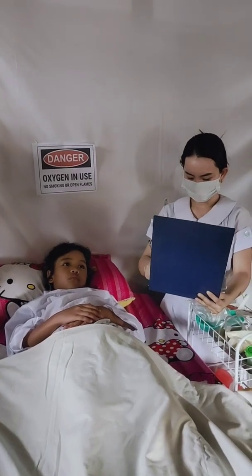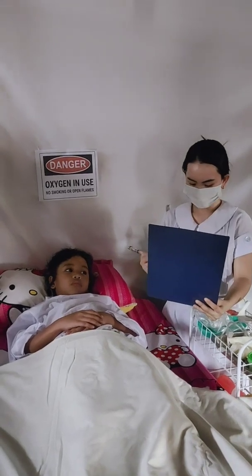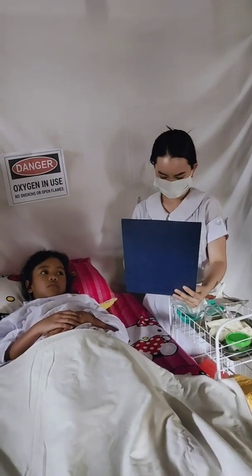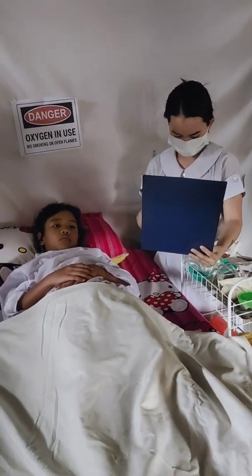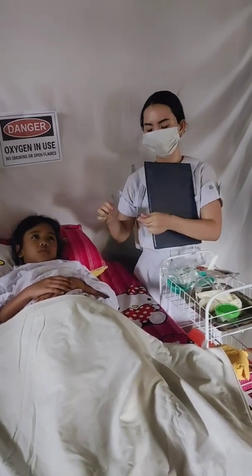Method of delivery through nasal cannula with a flow rate of 3 liters per minute. Patient's response is good. There are no adverse effects, reactions, or side effects after the procedure. The importance of documentation is that this will serve as the patient's record. That's all. Thank you.